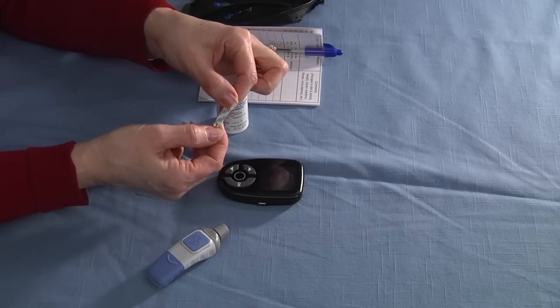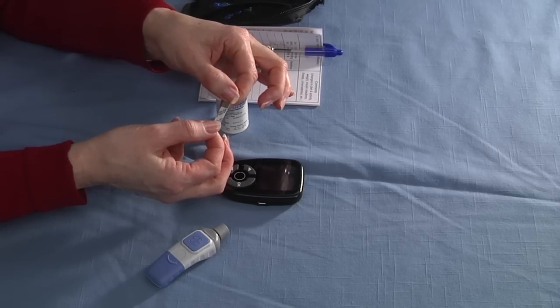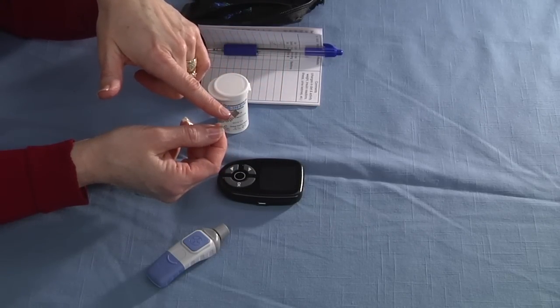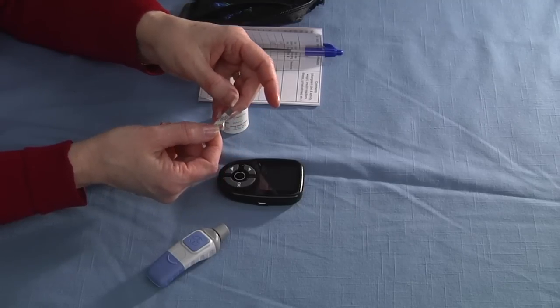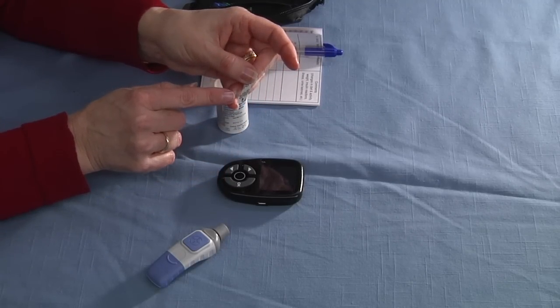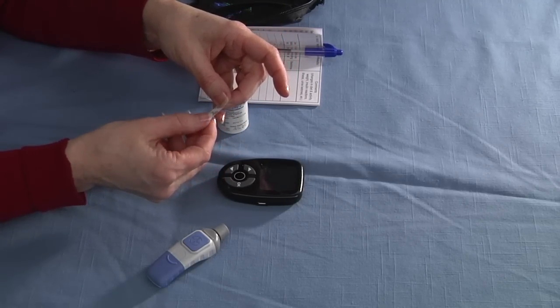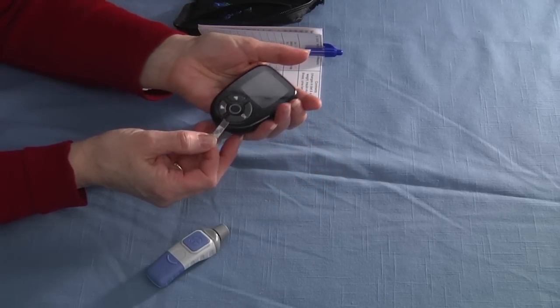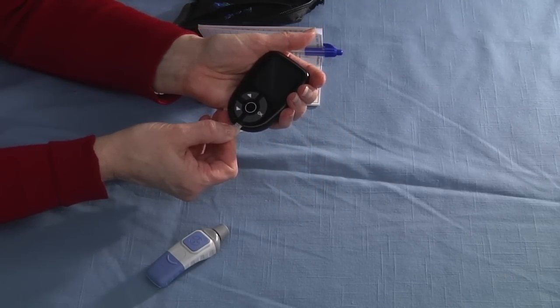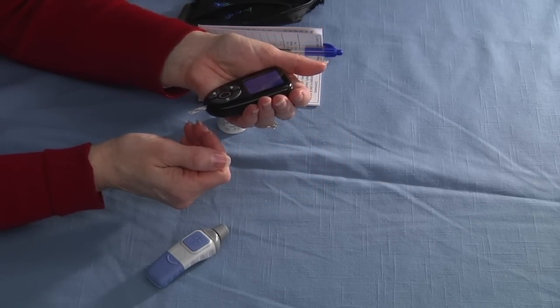These strips are very user-friendly, meaning I can touch them all over. The end with the lines is usually the end that will go into your meter. The side that has the little opening is where the blood will go. So pick up your meter, slide the strip in, and that will turn your meter on.